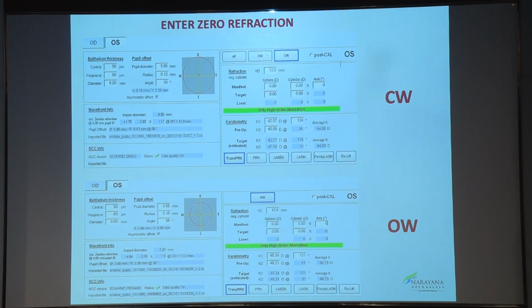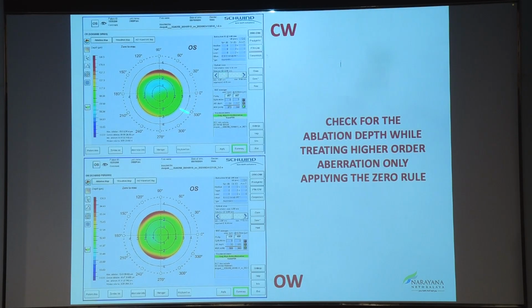So my question is, you'll have to first do the aberrometry, and only then can you use it? Exactly. Basically the workflow is you do the aberrometer, you do the topography. I'm giving you an ideal situation. What you have today is different, but you should know that there is a situation like this. You do one, you do the other, then in a click of a button you can compare both of them. Then you can move forward, please. This is what I said: in a click of a button, you have two screens coming up.